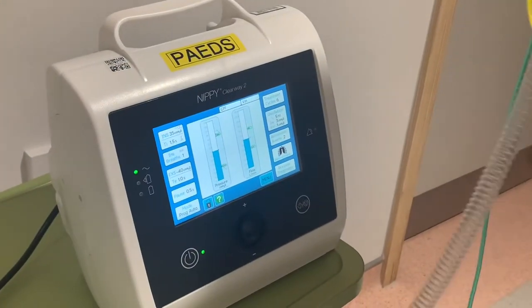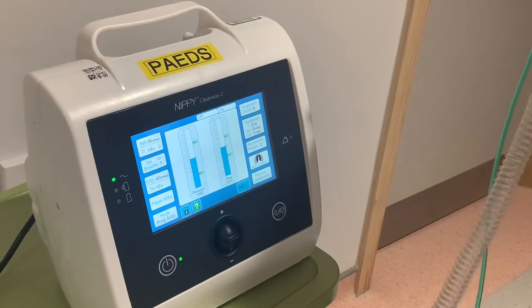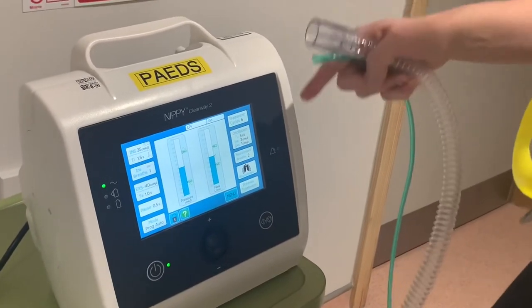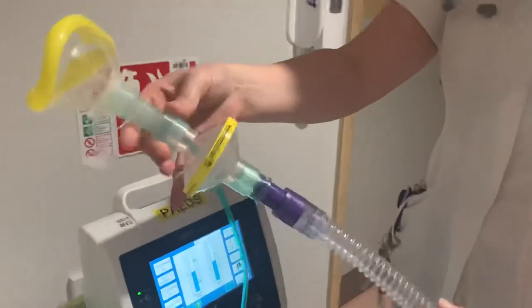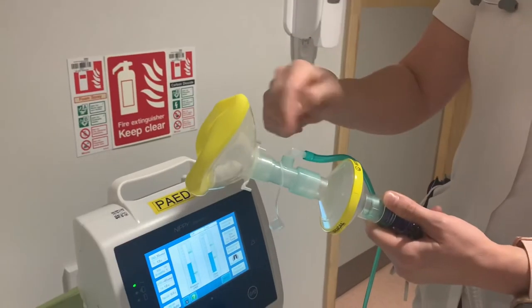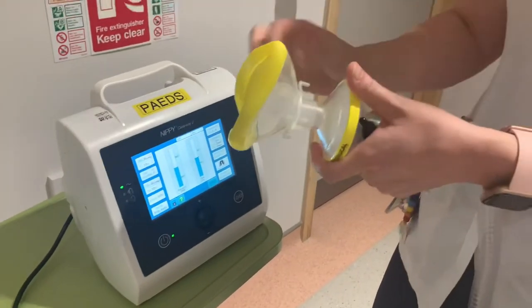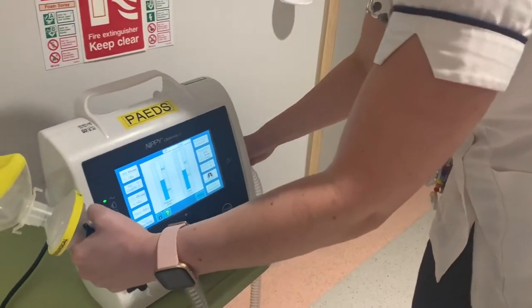The circuits have also changed since the old Clearway. Jackie has kindly bagged up Clearway 1 and Clearway 2 circuits in the respiratory cupboard to show which ones we're using. The difference is that the Clearway 2 circuit has no pressure line — it's otherwise exactly the same. The oxygen is entrained the same way, connecting to the wall or whichever oxygen source, and reattaching is the same as the previous circuit.